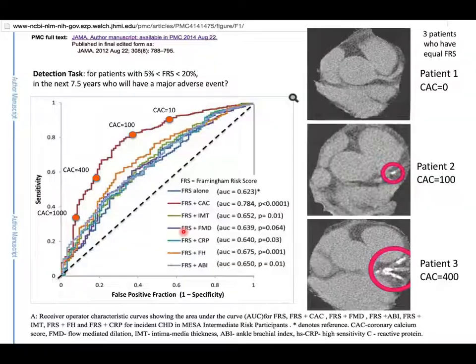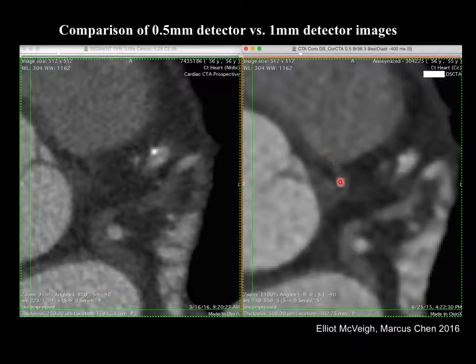Right? Any questions about this? It's a very interesting, not just technical and physics question. It's like, can we make pictures of reasonable quality at that high resolution? Right? It's also an interesting business question. Do people want 1K by 1K or 2K by 2K CT pictures?